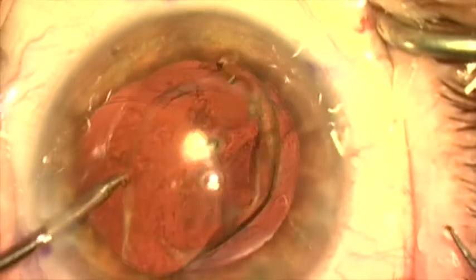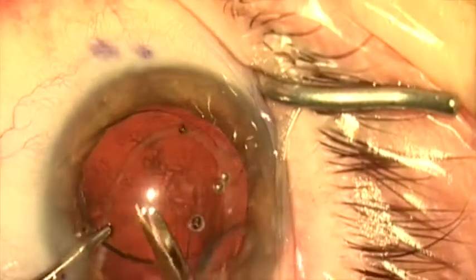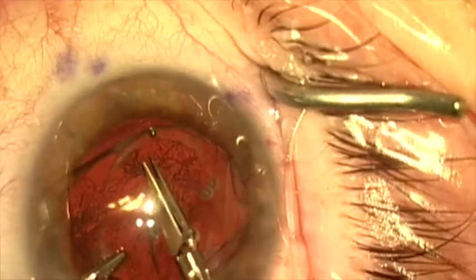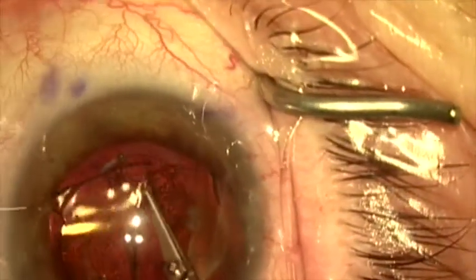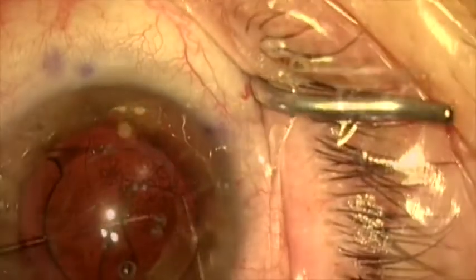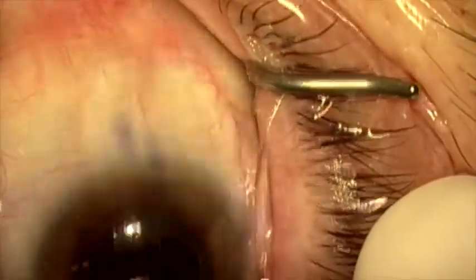The lens is now in the anterior chamber where we can center it, cut it in half, and take it out. When I cut the lens in half I'm going to turn the scissors sideways a little bit so there's less chance of nipping the anterior capsule by accident. When I remove the lens I'm going to try to protect the back of the cornea with a Sinski hook.